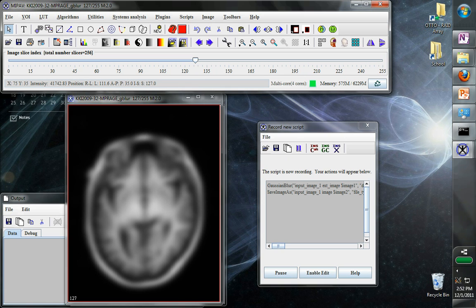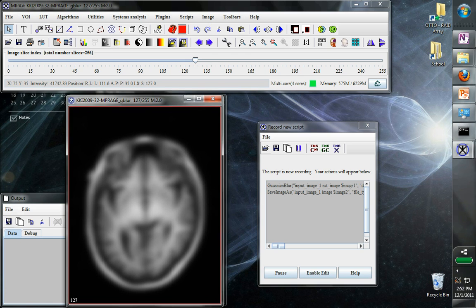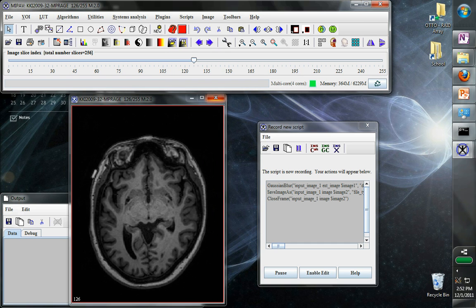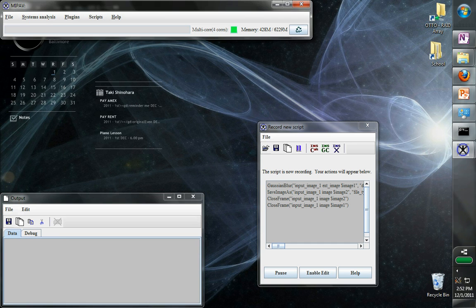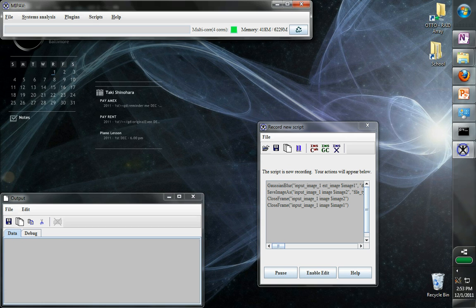So the next thing we might want to do is say that we're finished. If we just run this script as it is on a whole bunch of images, all the images will end up blurred and saved, but we'll have both the original and the blurred images open. If we're going to do this to hundreds or thousands of images, that's not very feasible. We're going to run out of memory because we're stacking it. So what we can do here is just take this blurred image and close it and close the original image as well. Here you can see that MiPav knows that we've closed these images now. We may also want to tell MiPav that any of the memory that we've reserved, any steps we actually don't need anymore. So we can hit this garbage collect button.